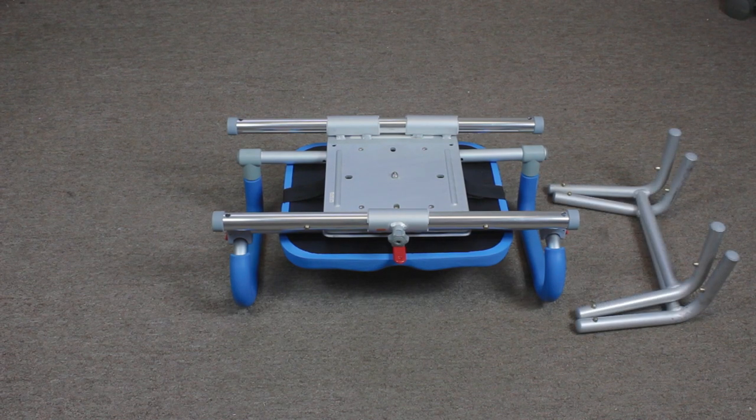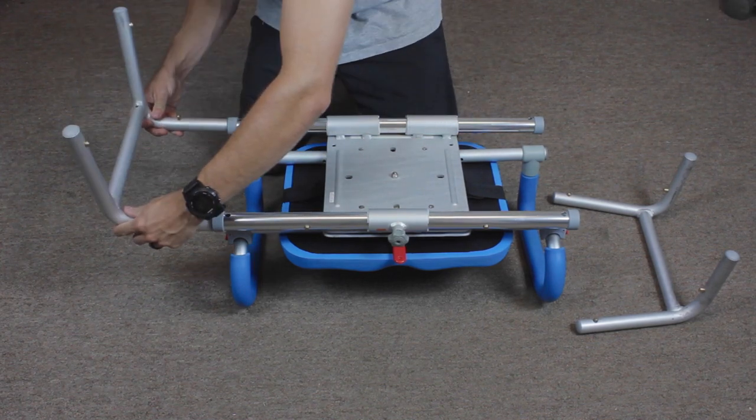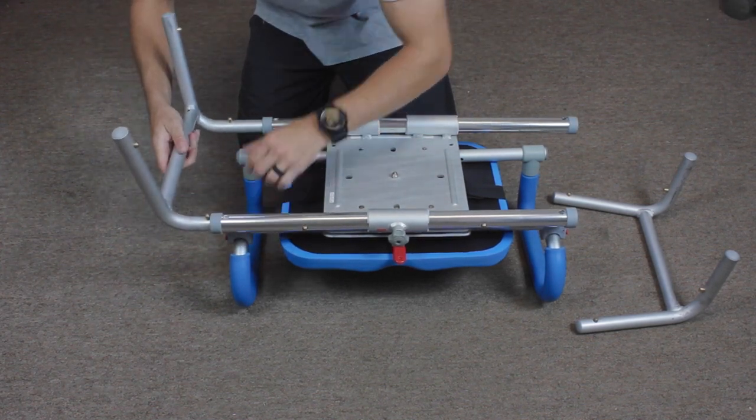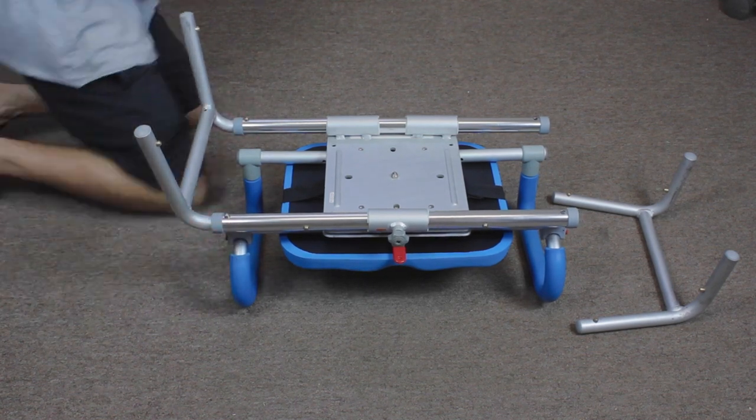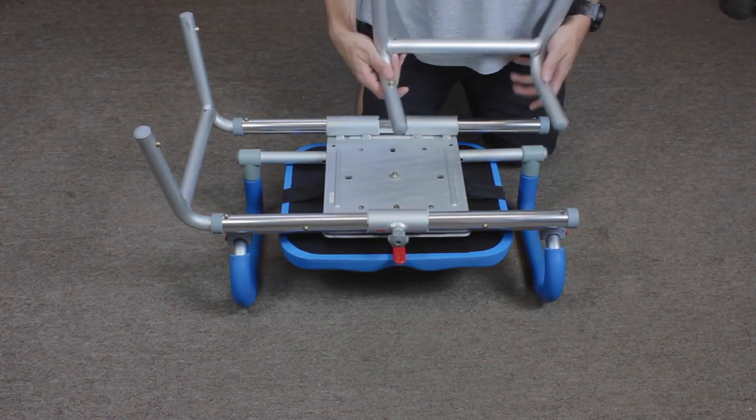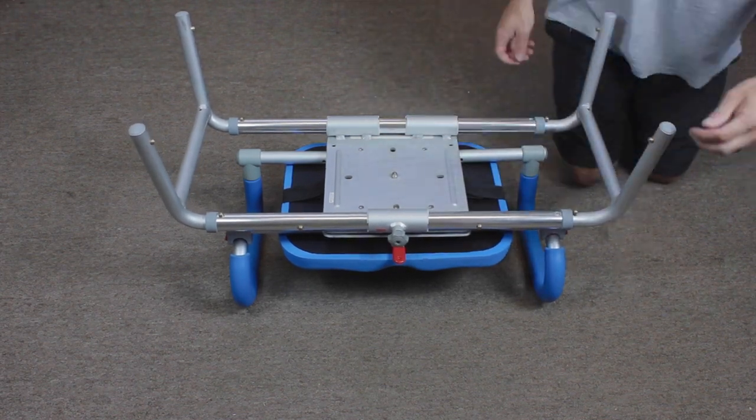Next you want to grab the leg brackets and install them into each horizontal rail. You'll notice that there are circular cutouts on each horizontal rail and the brass buttons on the shorter end of the brackets is what goes into the horizontal rail.